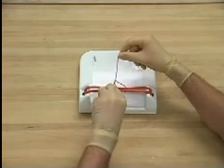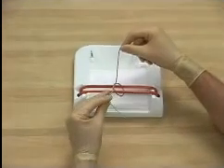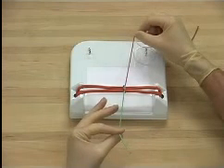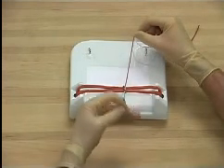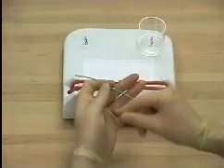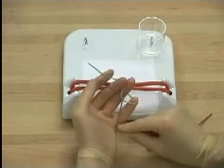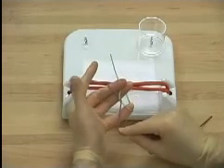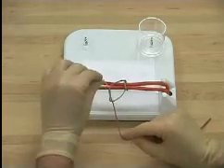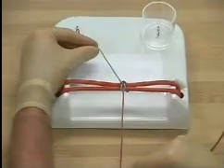This maneuver requires purposeful wrist rotation. The free end is then pulled towards the surgeon. The fingers are then placed on top of the suture, the hand supinated, placed palm up, the suture crossed over the fingers of the tying hand, and again the free end delivered back into the fingers of the holding hand, bringing the end through the loop so created, and this time the free end is pulled away from the body, thus creating a square knot.